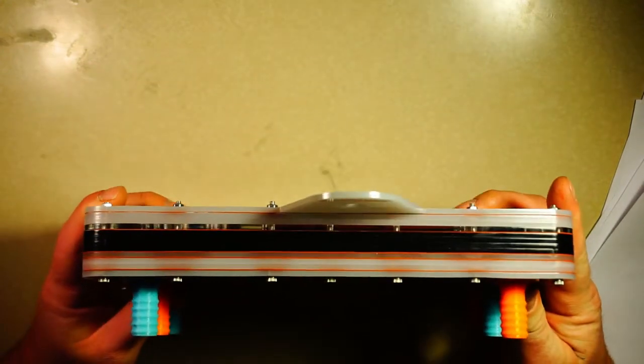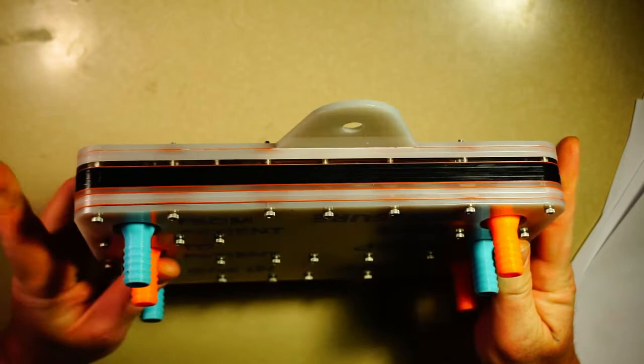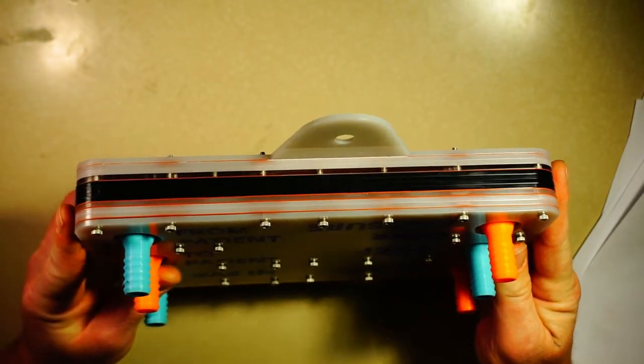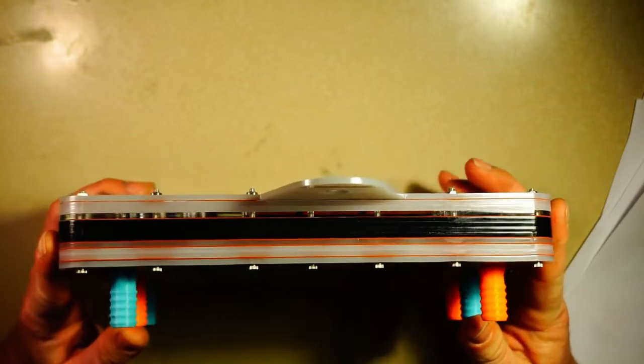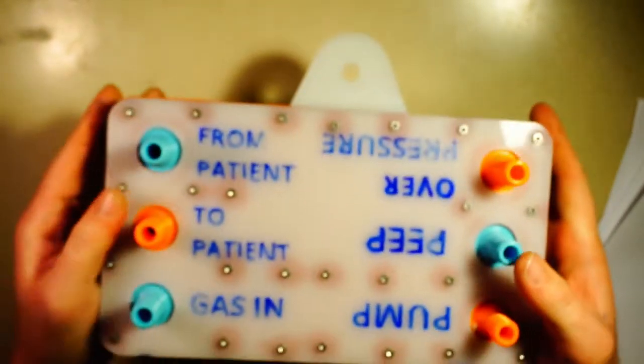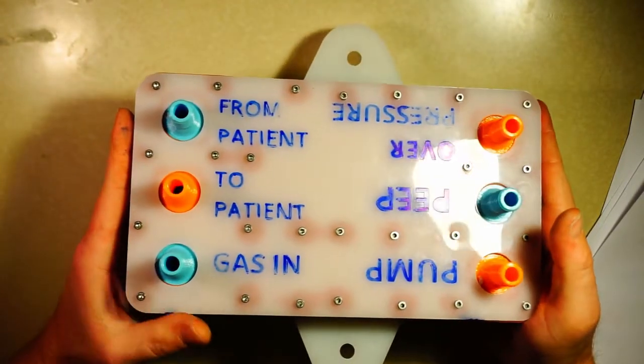So you can see it's a series of flat, laser cut acrylic, along with some flat, laser cut silicon pieces. And it's got a bunch of M3 screws and nuts on the backside holding this whole piece together.